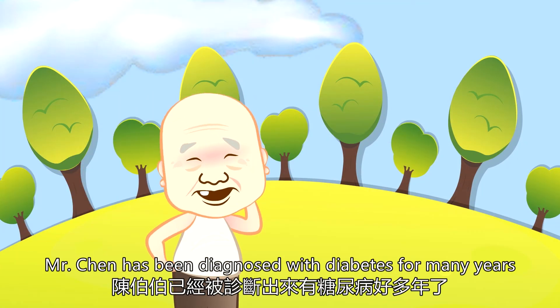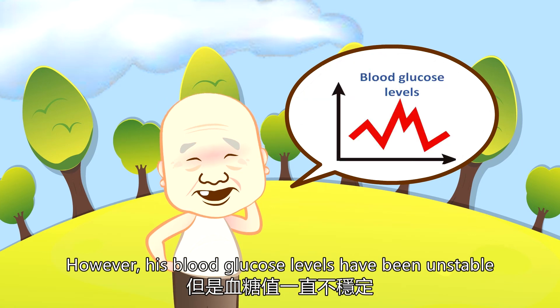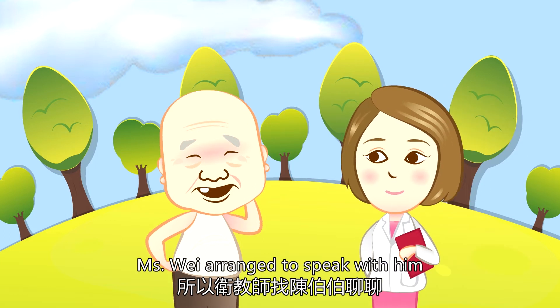Mr. Chen has been diagnosed with diabetes for many years. However, his blood glucose levels have been unstable. His diabetes educator, Ms. Wei, arranged to speak with him.